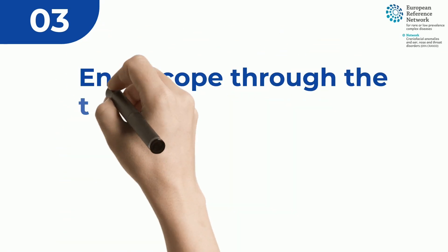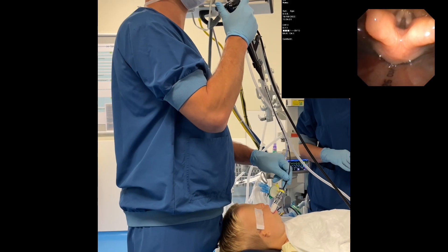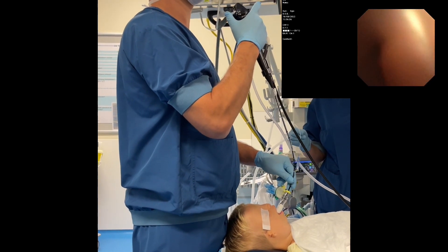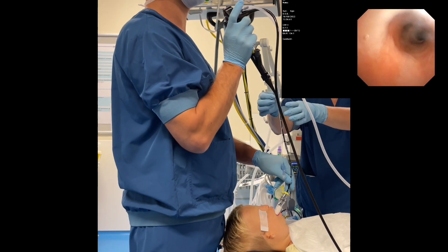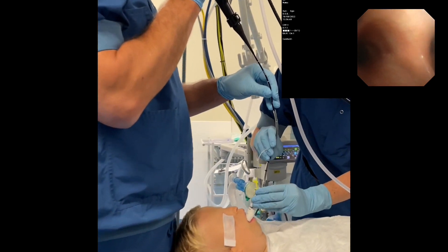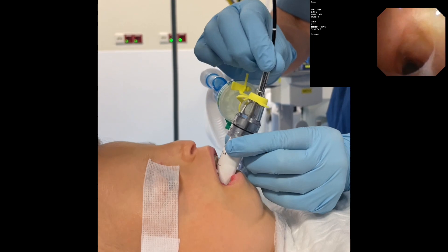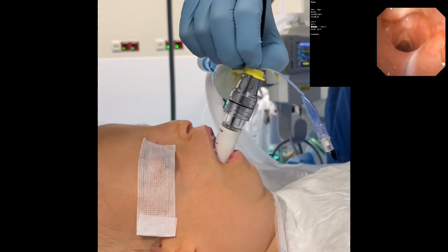The flexible scope is passed through the vocal cords down into the trachea up until the level of the carina. Then the endotracheal tube is slid off the flexible scope into the tracheal lumen. After the correct position of the endotracheal tube in the trachea is confirmed, the flexible scope is retracted from the endotracheal tube and the 15mm adapter is replaced on the tube.